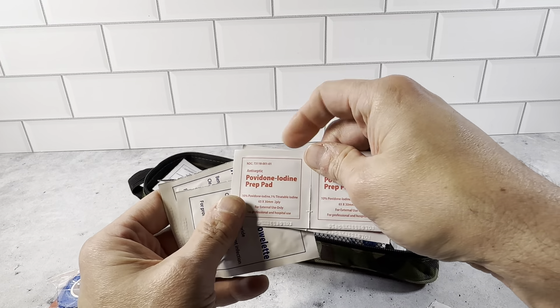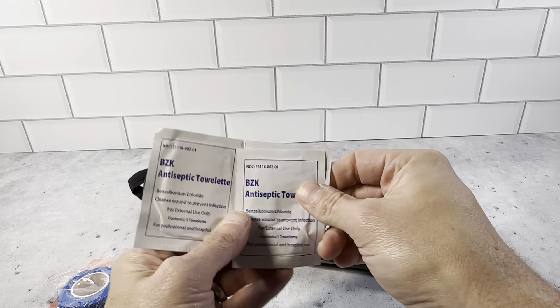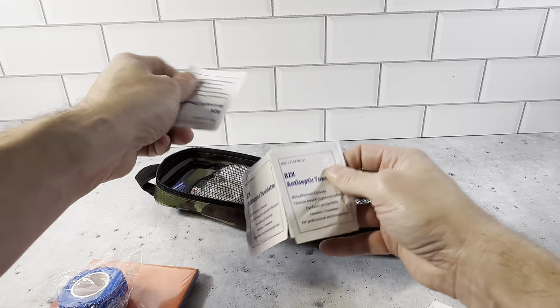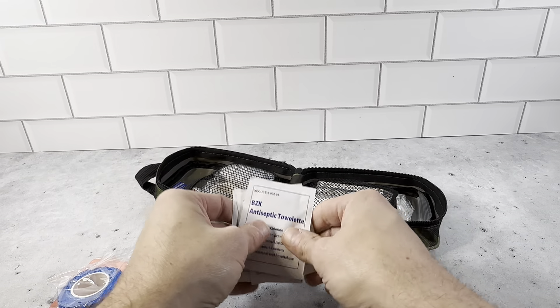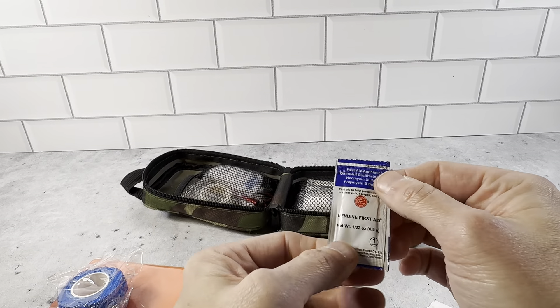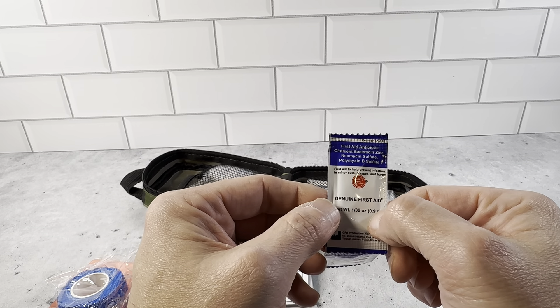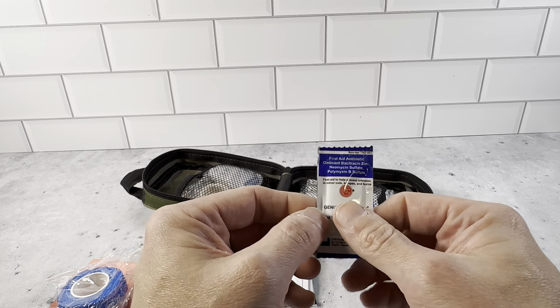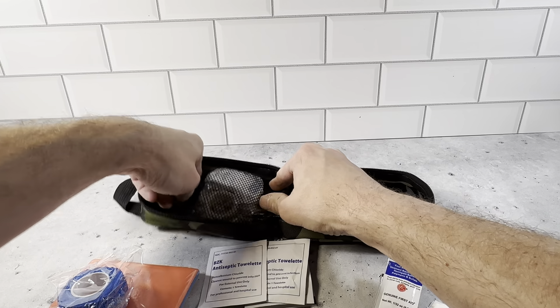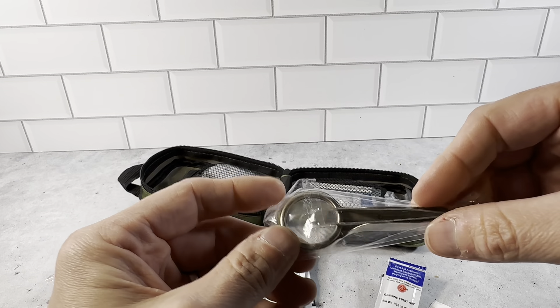You have the Povidone Iodine Prep Pad. You have the antiseptic towels. This kit is put together super nicely. We have the first aid antibiotic ointment.